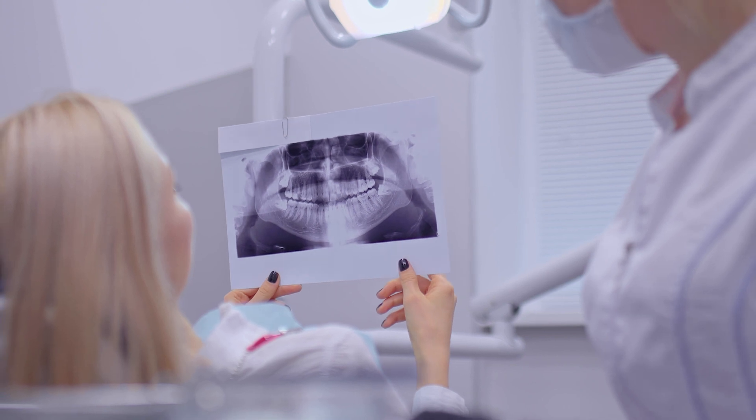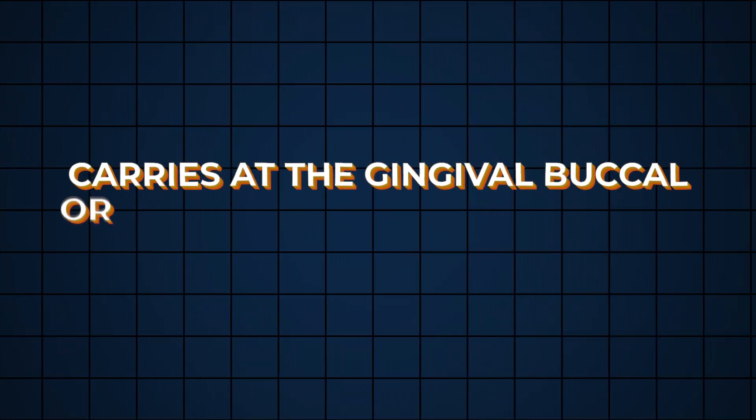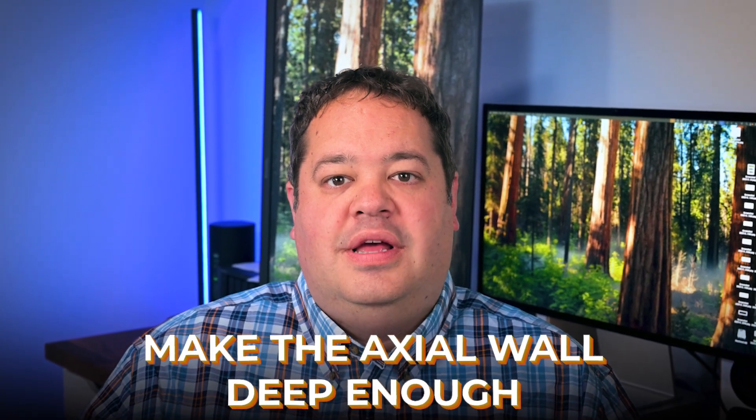When I prep a tooth, I try to make note of any remaining decay and consider if it was an error in my diagnosis or a mistake in my prep. Sometimes you just can't see everything on an x-ray and you'll have something slightly larger than expected — you can't really do anything about that. However, I have found that most of the time you end up with a little demineralization or caries at the gingival buccal or gingival lingual line angles. So when I make my passes for those two walls, I will flare the burr a little bit, making the floor slightly wider at the base than at the top. Just a little flare with the burr actually improves things quite a bit and eliminates that little bit of demineralized enamel or decay that would often otherwise remain in that spot.